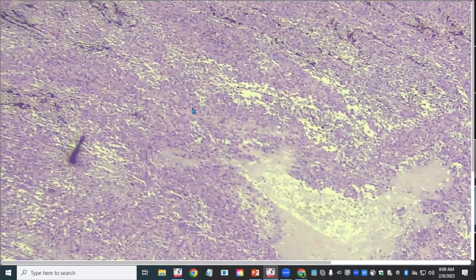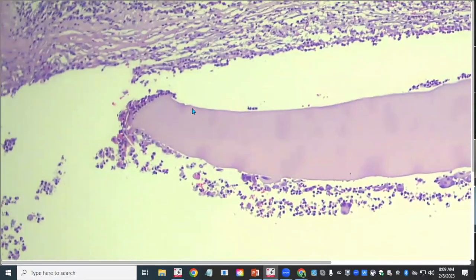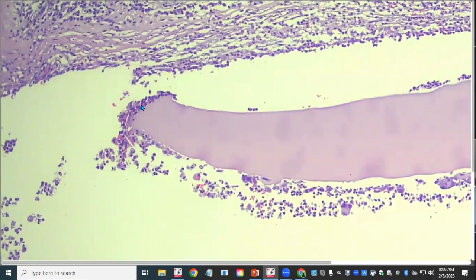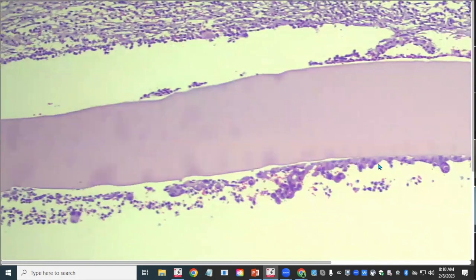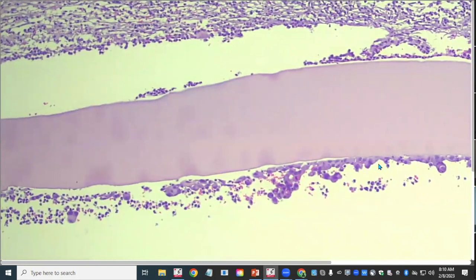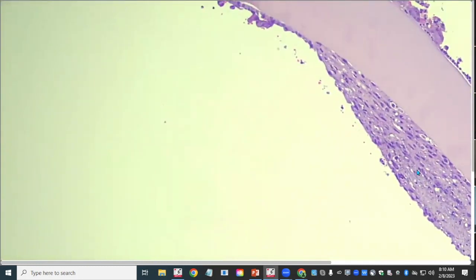Looking at the lens capsule — which I said was broken and genuinely is — there are small cells nibbling at the broken edge and neoplastic cells inside the capsule. Tracking along, they carpet the inner lens capsule, becoming thicker and more spinduloid or fusiform in morphology.